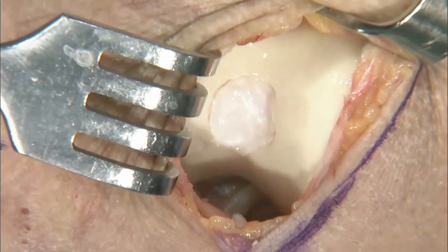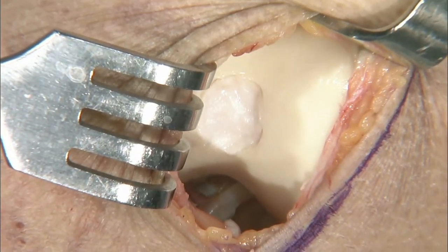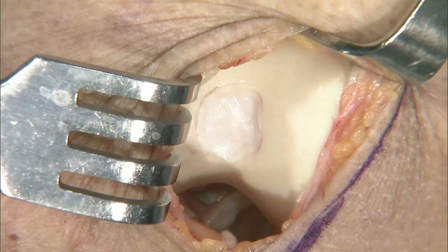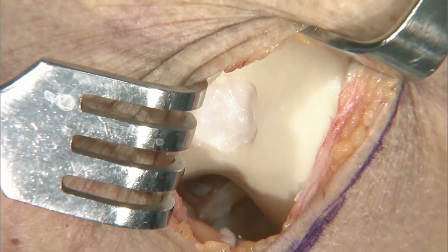But if you look at this, the membrane really hasn't moved at all with cycling that knee and closing it down. And that was a very, very minimal amount of fibrin glue that I put into the defect. And I didn't put any around the rim.